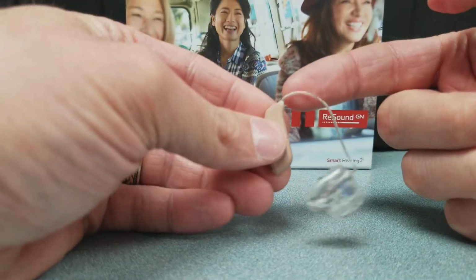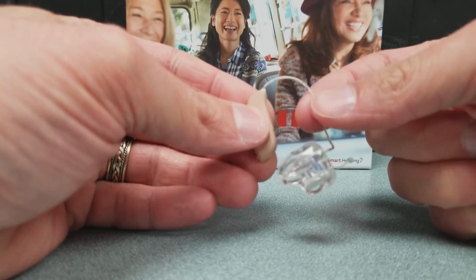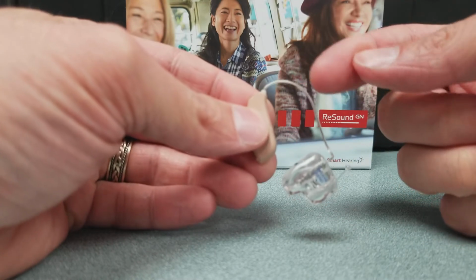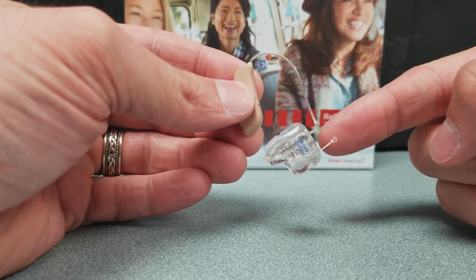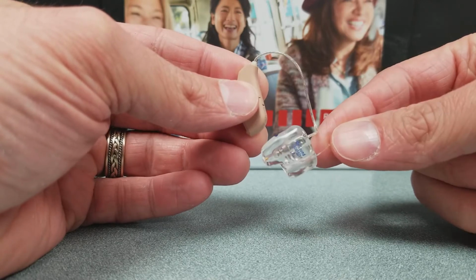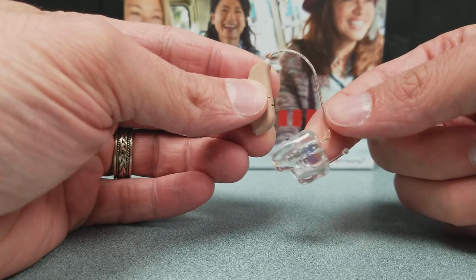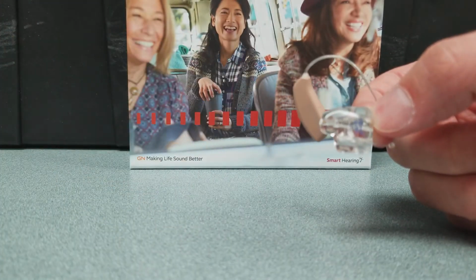Moving on. This piece right here is called the receiver wire. We do not want people to yank on this, because if you get a hard bend in there, there actually is a wire that can get broken. We have this piece right here, which is called a removal string. You use this to remove it from your ear. If that is not an option for you, then you can find this piece that is straight that you can pull out like so. Okay.